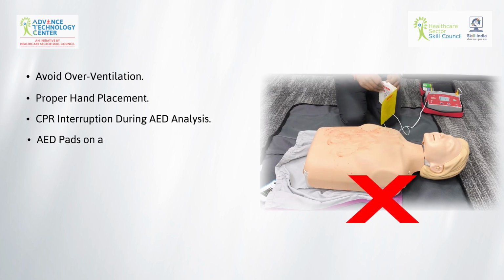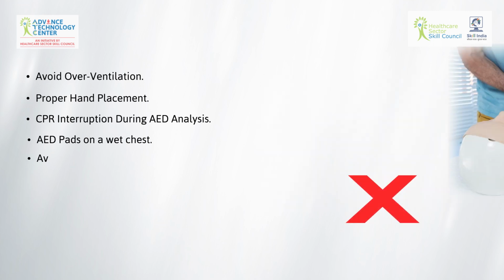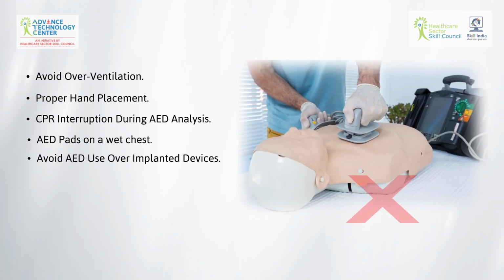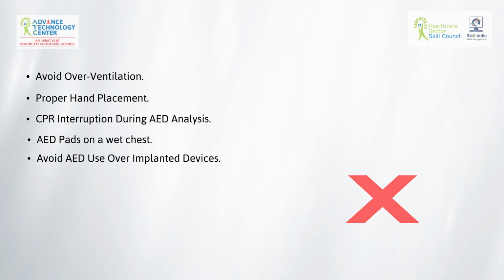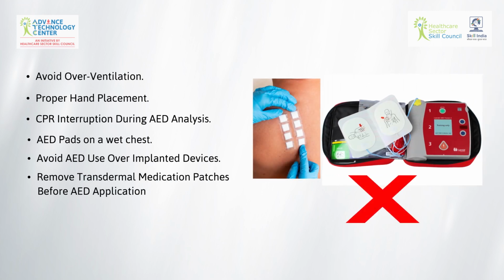AED pads on a wet chest: ensure the chest is dry before applying AED pads. Avoid AED use over implanted devices: if the patient has a pacemaker or defibrillator, place pads at least 1 inch away. Remove transdermal medication patches before AED application.